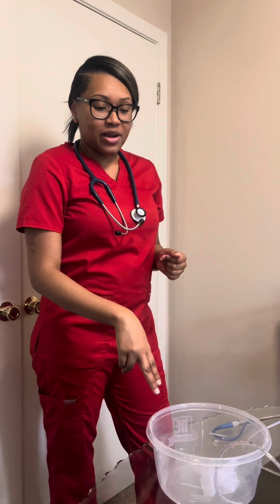Hello, my name is Victoria, I'll be your nurse today. Can I get your name and date of birth? I will check the armband. Okay, so today I'll be doing an enteral feeding through your NG tube.